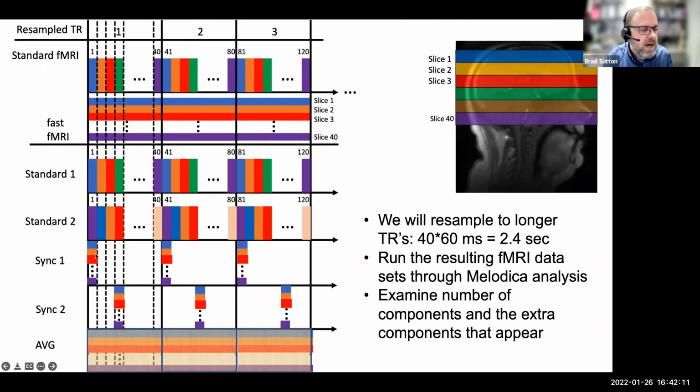So I can do that, and I can choose which one of these bins I want to actually produce that image in. So here's synchronized sampling 2. I chose something out here, okay? Halfway across this, okay? And I stack all those slices together.